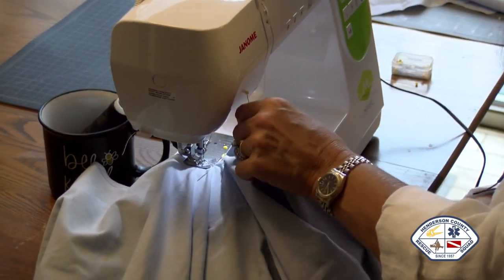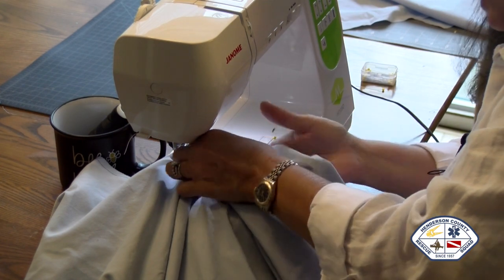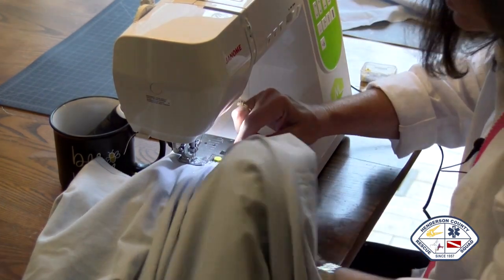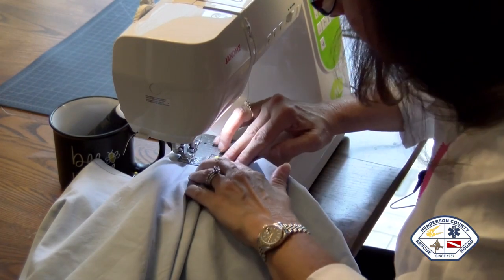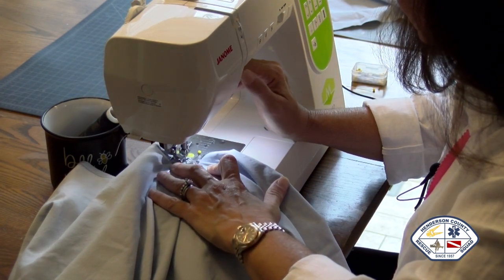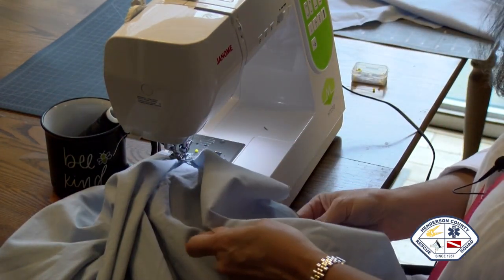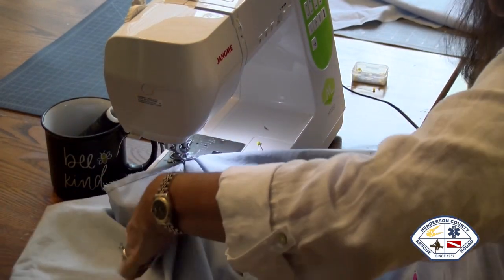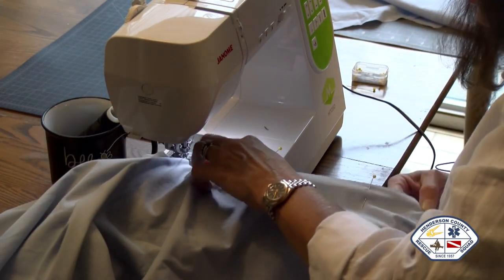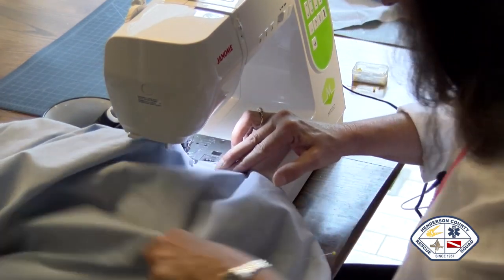Okay, now I'm at the bottom of the sleeve. You want to make sure nothing's all wadded up under there because, you know, this isn't the way you traditionally do a sleeve. You kind of have to wiggle it a little bit. I still have a little bit of bump under there. There we go. I'm going to go to that point. I'm going to back up and reinforce it just a little bit, because that's going to be an area of tension. Now we'll turn and go up the other side.